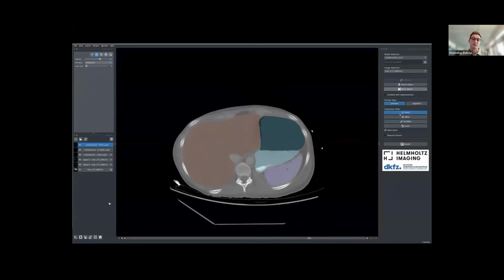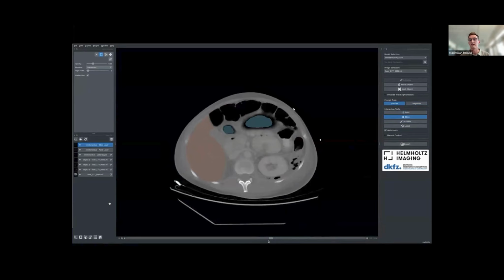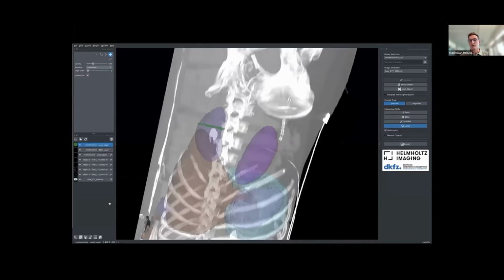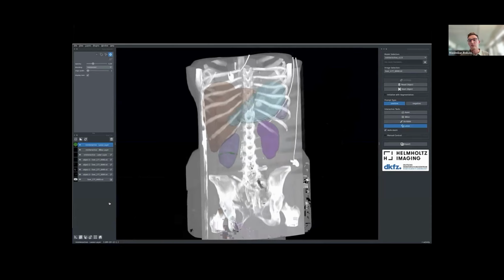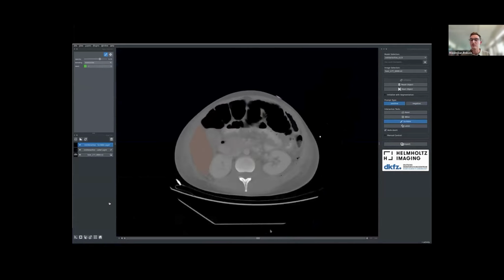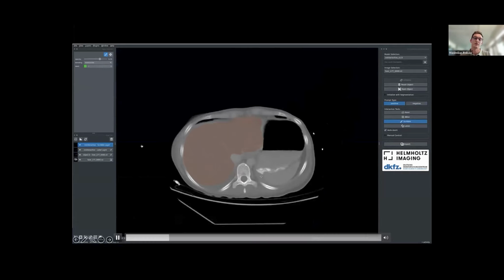And again, as I said, box prompts work, point prompts work, and here I'm placing a box prompt, which immediately works. The box prompt is placed in one plane, so in 2D, and it immediately works as a 3D segmentation. What you just saw as a scribble, as a lasso prompt, and with that, in about 30 seconds, you immediately annotated a 3D volume. So this might be interesting to you, and also stuff you can check out.